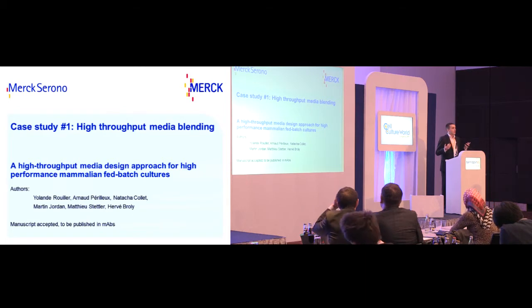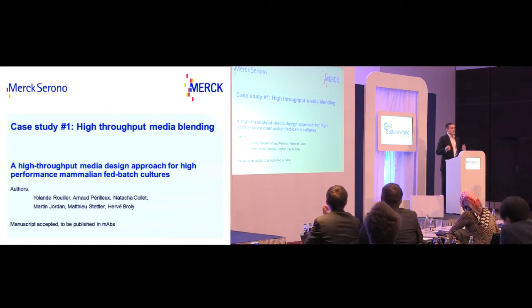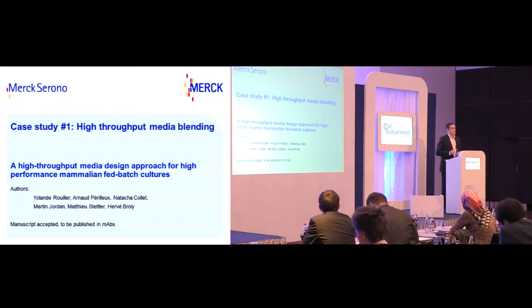You certainly know that media blending is taking 5-6 commercial media and blending them together to see what is the best combination. Here we are mainly focusing on the development of our proprietary medium.